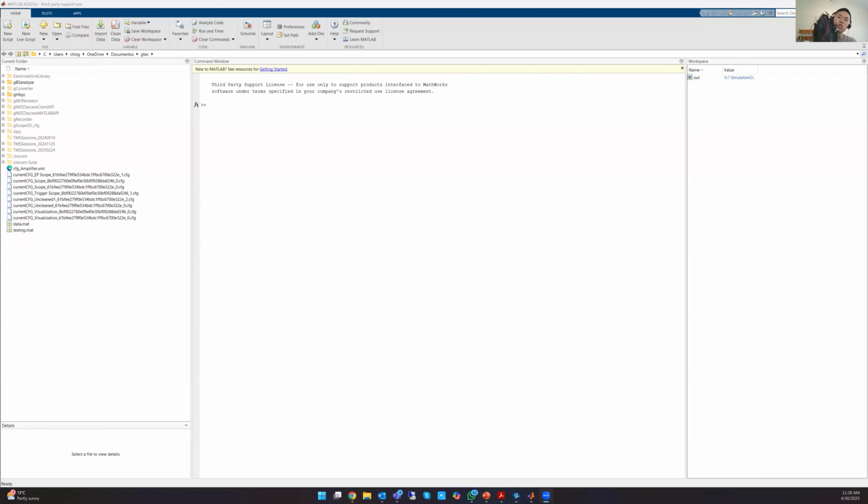If I'm using EEG with EKG just today, I can actually combine everything using one single amplifier. You can just detach the strand here. It's a 1.5 millimeter touch-proof connector. You can attach different types of cables, as long as it's a passive cable.